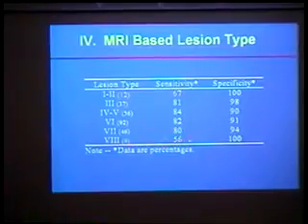The reason we believe of this relatively low number on sensitivity on those is because we don't have enough samples. These are taken from patients who have had surgery. So we are truly looking at a very biased group of lesions. And if we started looking at a group of subjects like you guys sitting in this room, we should see a lot more in this group, relatively normal cases.